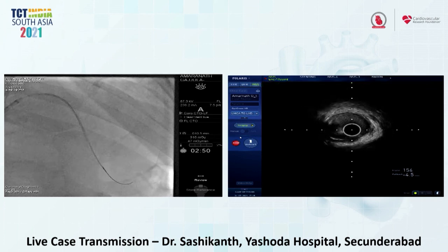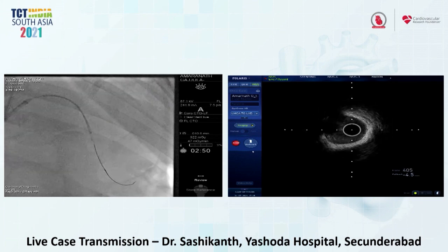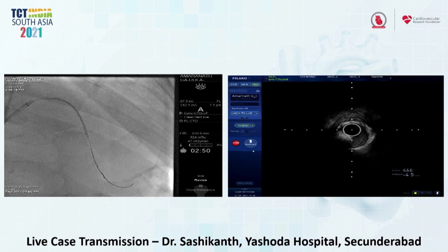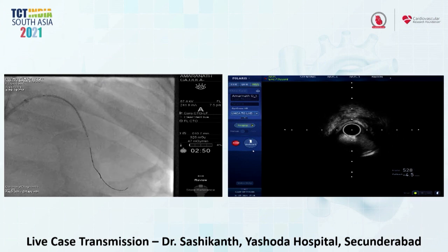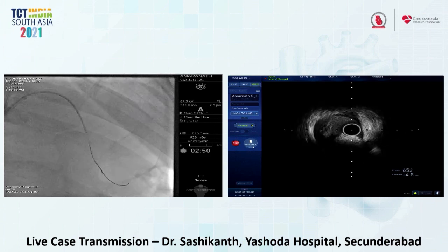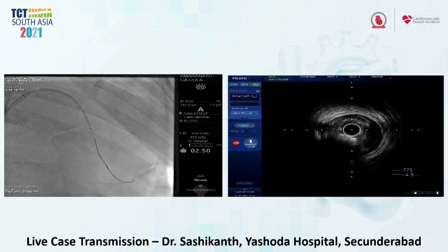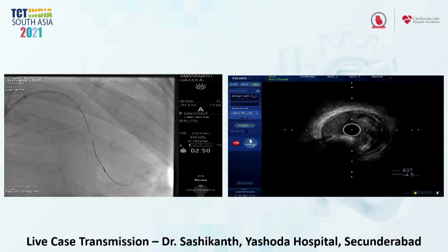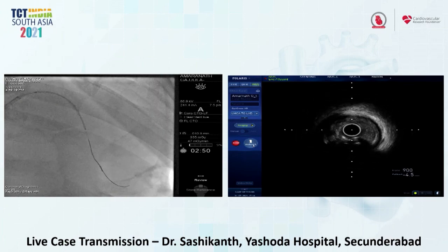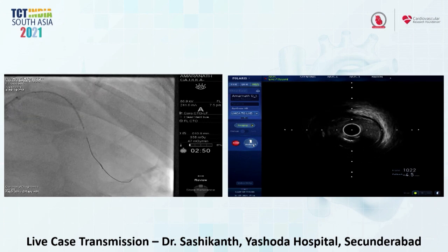So we fix the position of the stent, pull the IVUS catheter back up to the ostium of the LAD. Visualize the ostium of the LAD and the circumflex where we have a healthy zone landing. Negative pressure, neutral pressure. So we took a 3 into 48 millimeter stent. The lesion measured 46 millimeters to be exact.